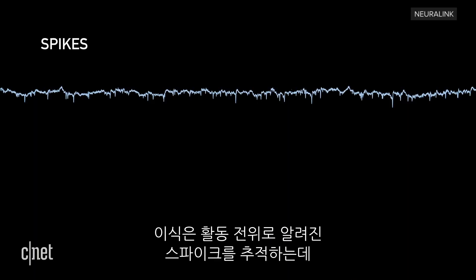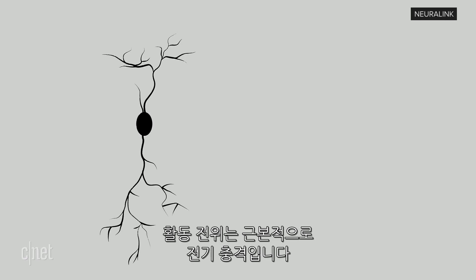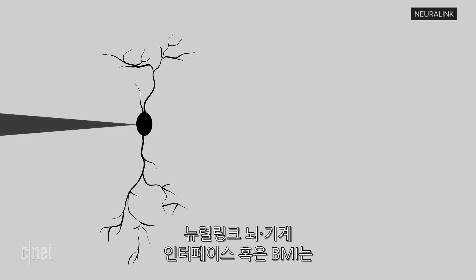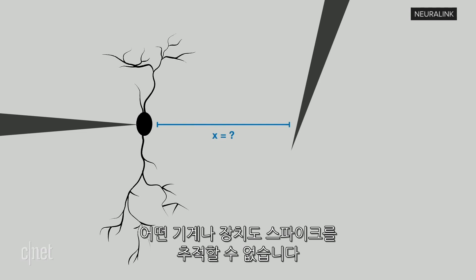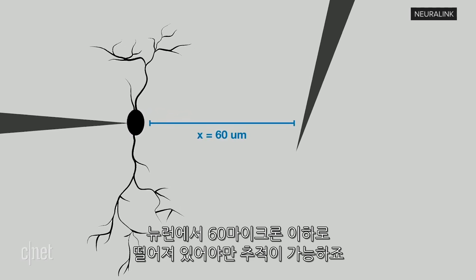At number five: why bother with a brain implant at all? The implant is trying to track spikes, also known as action potentials. Essentially, an action potential is an electrical impulse — a spike happens when a neuron sends information. Neuralink's Brain Machine Interface, or BMI, can track the spikes in real time. There is no wearable that can track the spikes because you need to be under 60 microns away from the neuron for tracking.